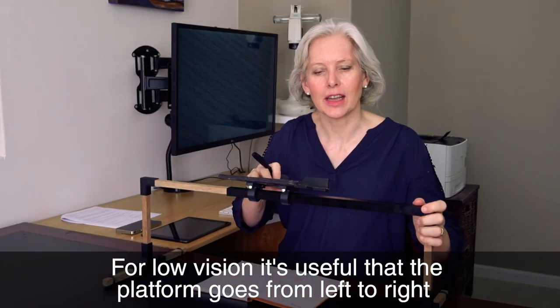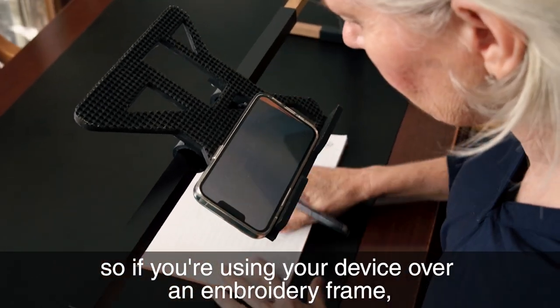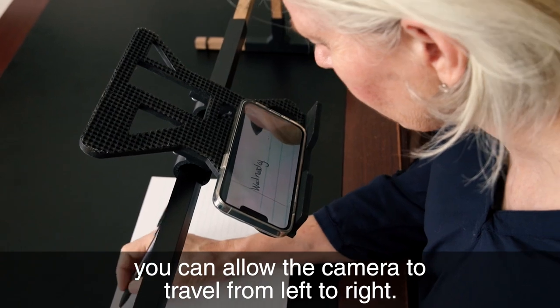For low vision it's useful that the platform goes from left to right, so if you're using your device over an embroidery frame you can allow the camera to travel from left to right.